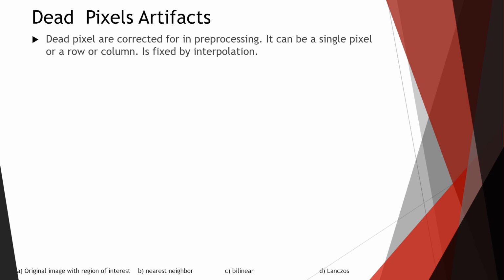and you don't even recognize it because it's kept to a regulated minimum. If the dead pixels on an IR become too great, then it needs to be replaced. I would say it needs to be fixed, but it's usually just fixed by the original equipment manufacturer and sent off, and a new one will be ordered and temporarily put in place in the facility. So it's being fixed by interpolation.